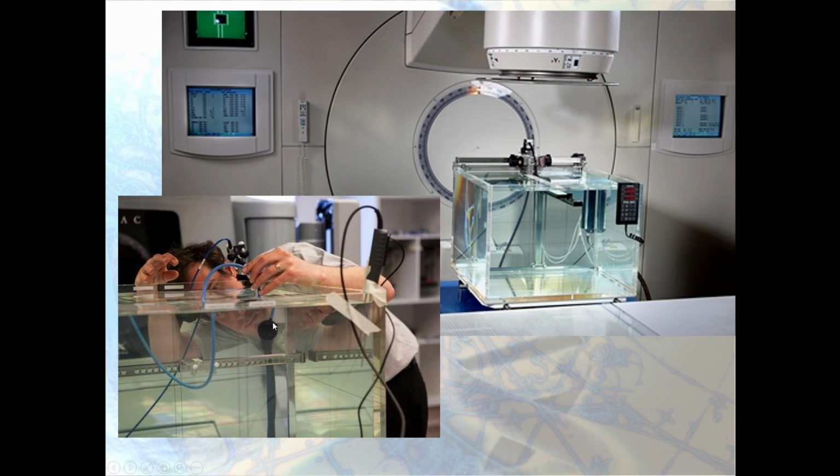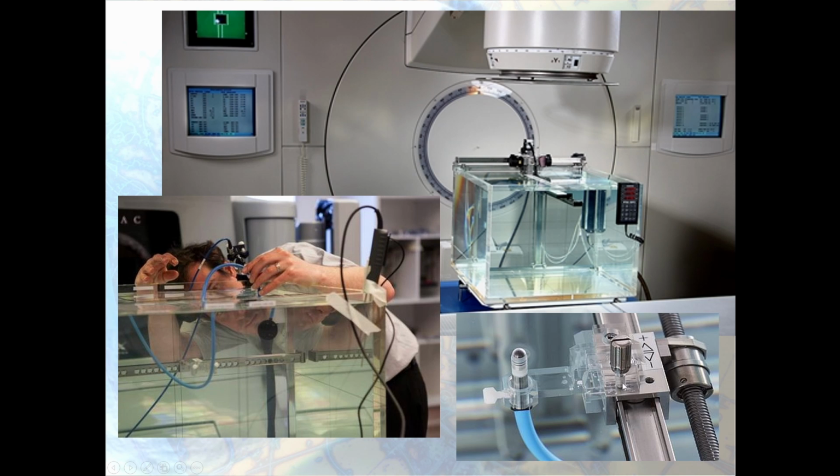The ionization chamber can look like this one, or a pinpoint, a very small tiny one, like that one. And you see that this chamber is connected to a tray.